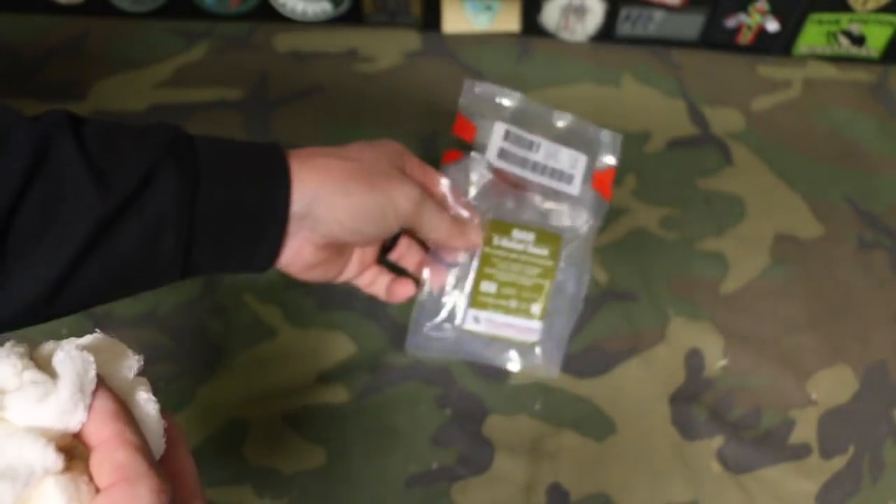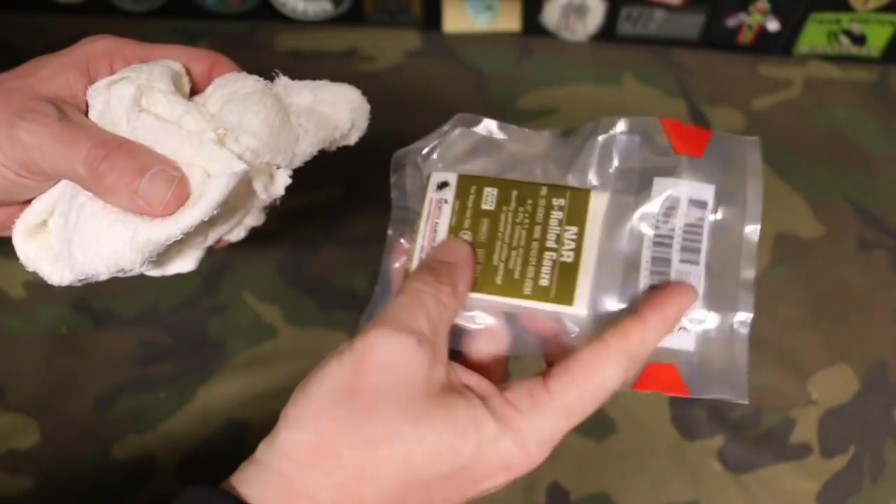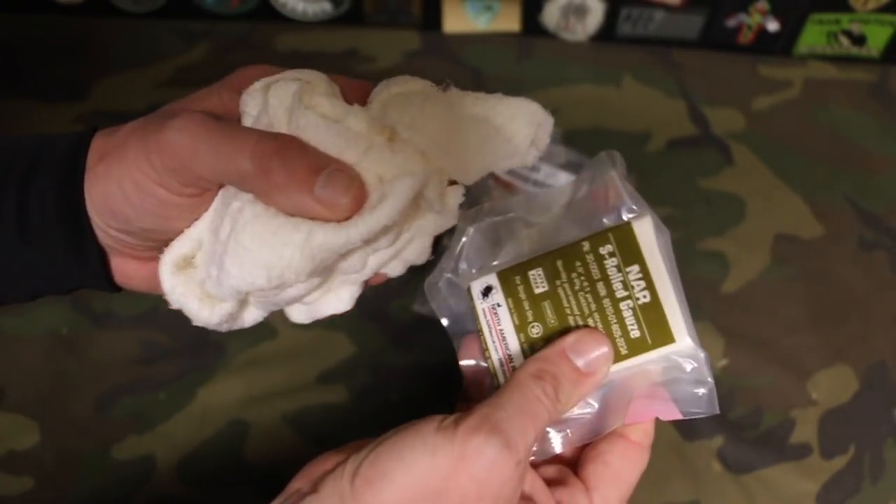It takes up a lot less room in your IFAK, trauma kit, or med kit than trying to fit this much gauze that's not vacuum sealed. So it's a huge space saver by getting it in the sealed packaging — you can see the size comparison of where we started versus now.